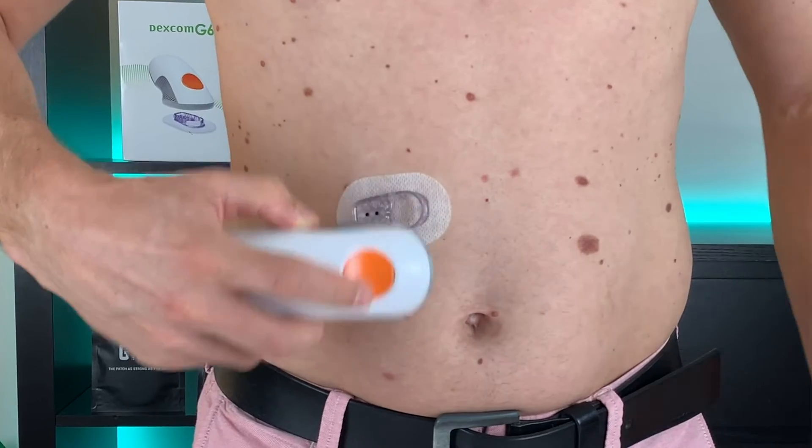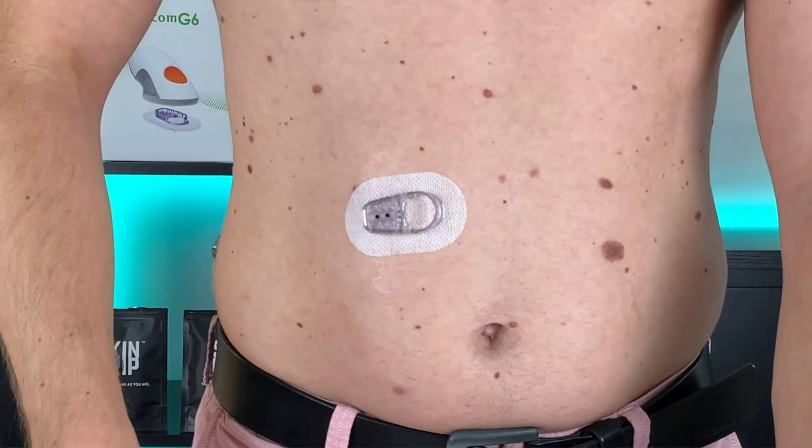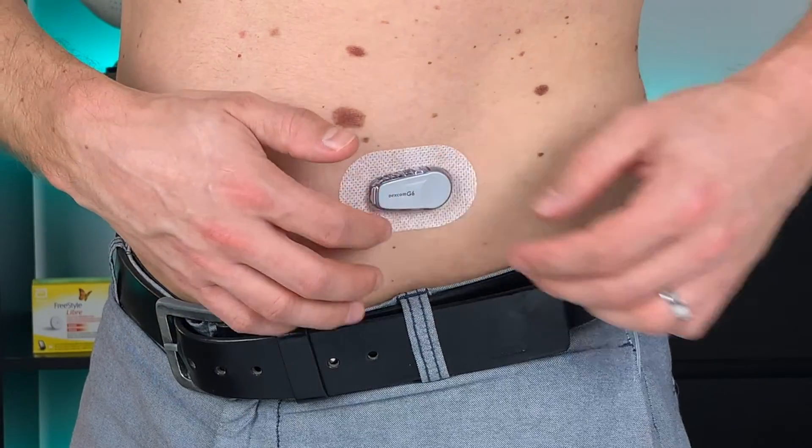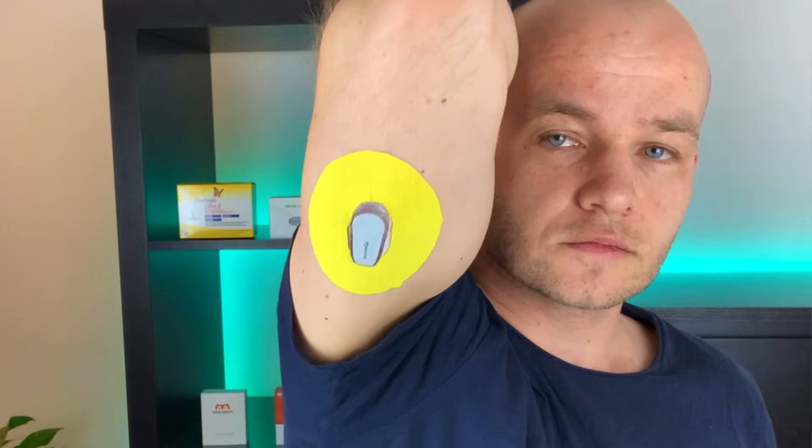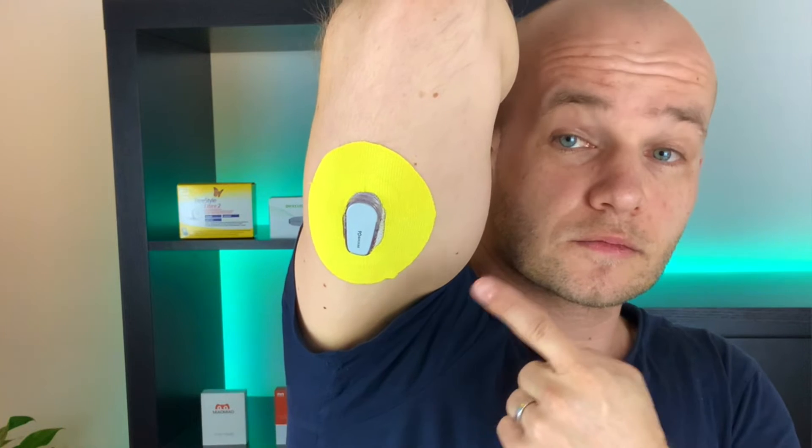Next, pick the spot where you want to insert the sensor. The Dexcom G6 is currently approved for use on the abdomen and upper arm, and if you are under 18 you can also put it in your upper buttocks. You should pick a spot that is at least three inches or eight centimeters away from your infusion sets or injection site to make sure you get accurate readings. Try to avoid areas like ribs, hip bones, and spots with scarring, tattoos, excessive hair, or irritation.